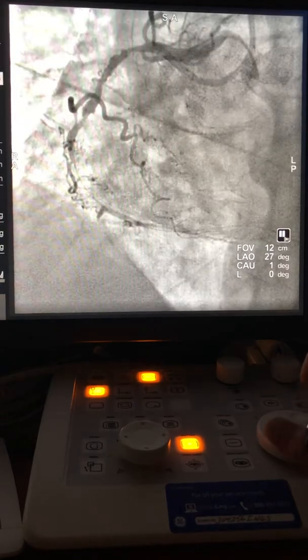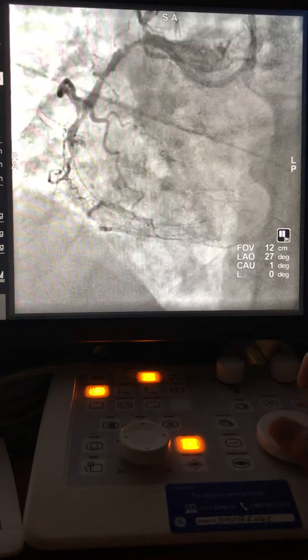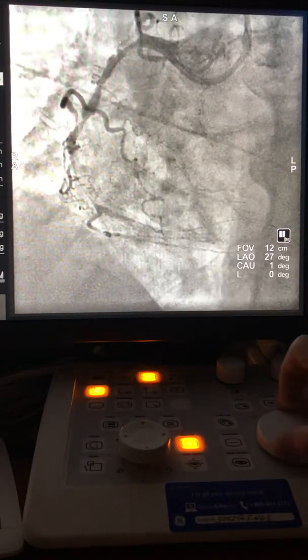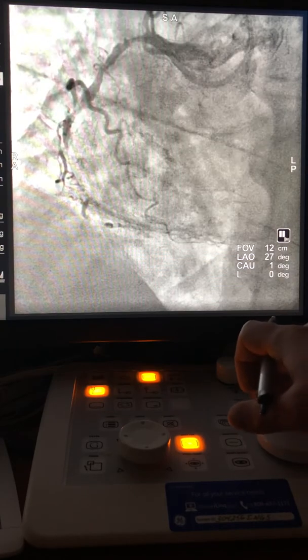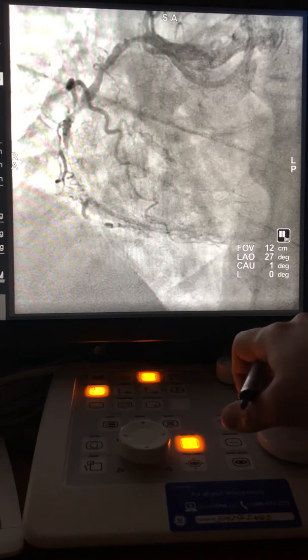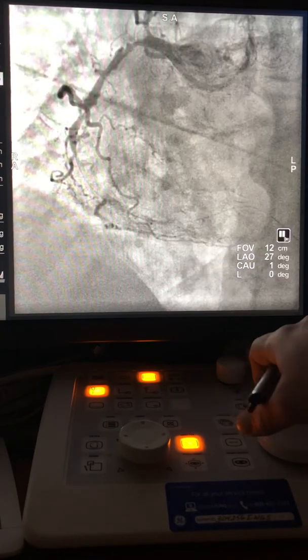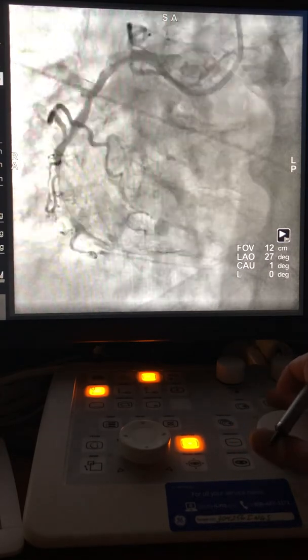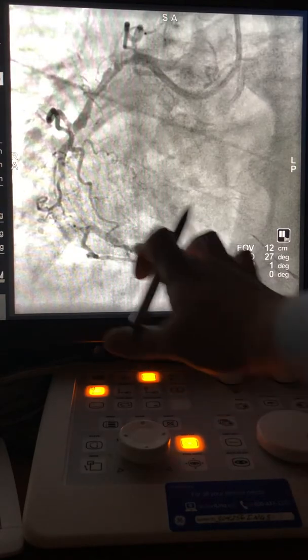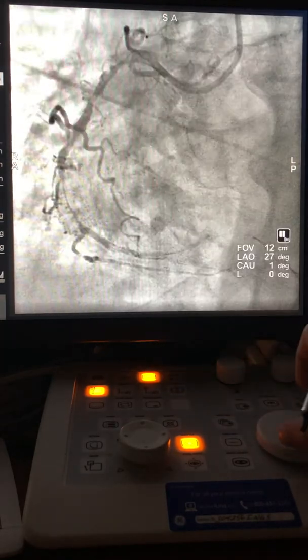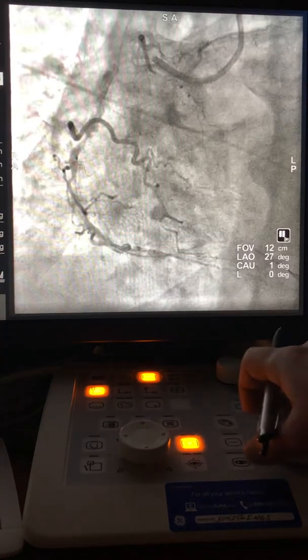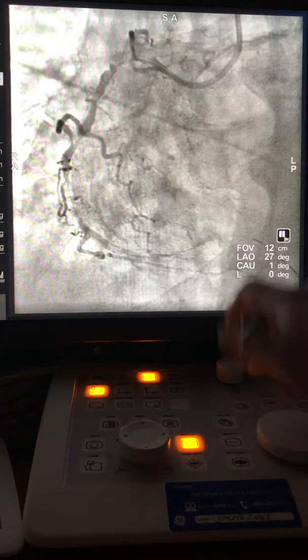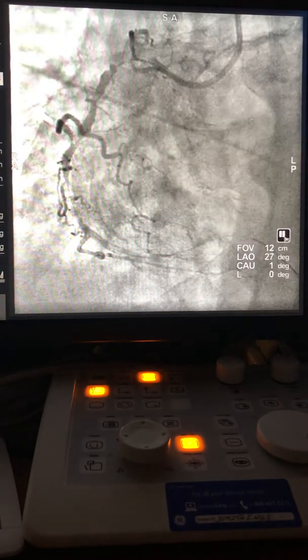The wire has passed — that's the most important part. You see the wire in the true lumen, and there is a buckle in the wire here, which confirms it is in the true lumen. Don't balloon in this area until you are 100% sure it is in the true lumen. This is the wire; this is the balloon.